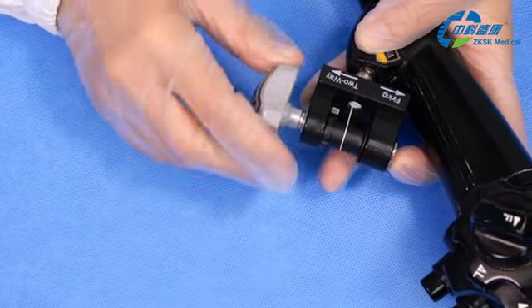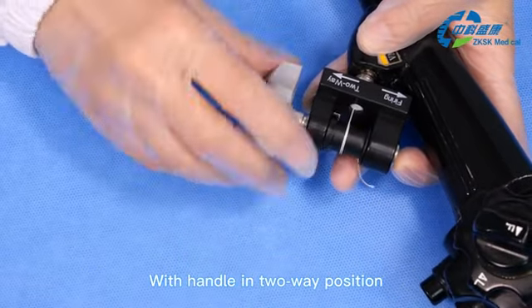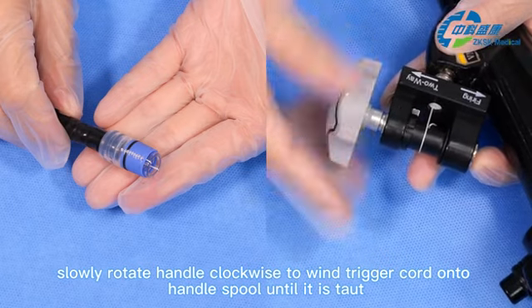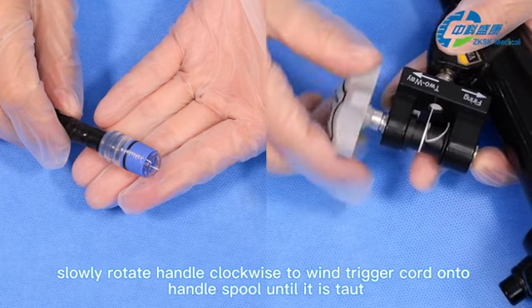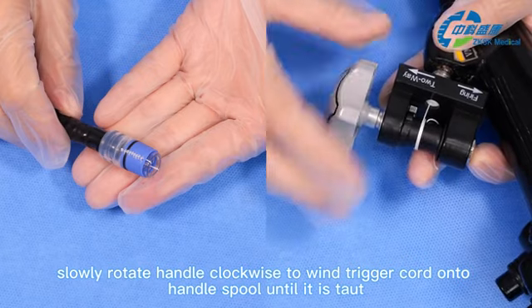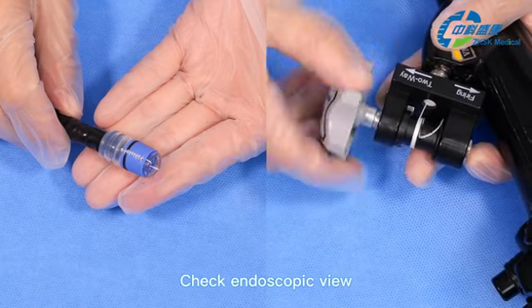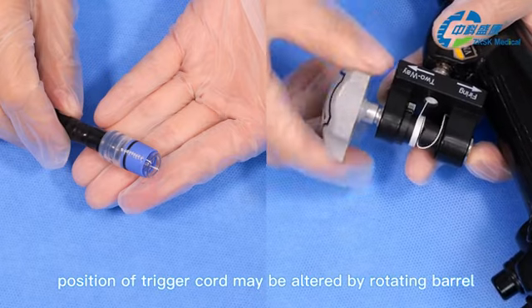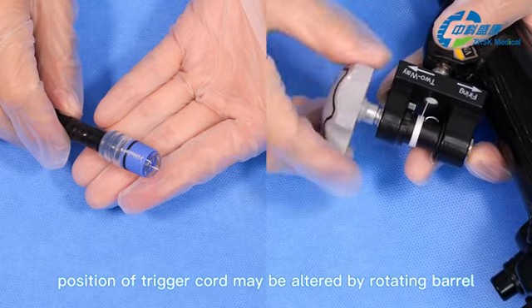Seventh, with the handle in the two-way position, slowly rotate the handle clockwise to wind the trigger cord onto the handle spool until it is taut. Eighth, check the endoscopic view. To maximize visualization, the position of the trigger cord may be altered by rotating the barrel.